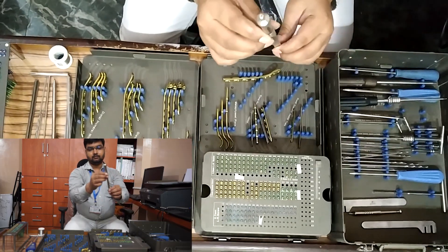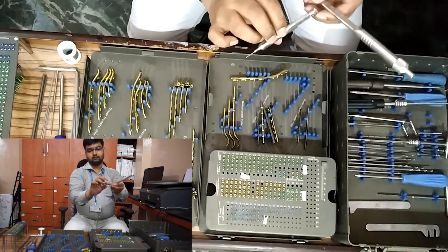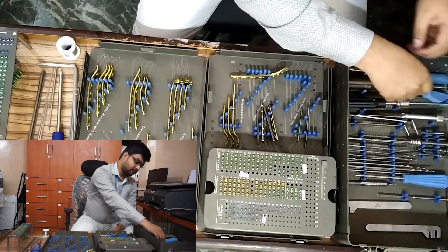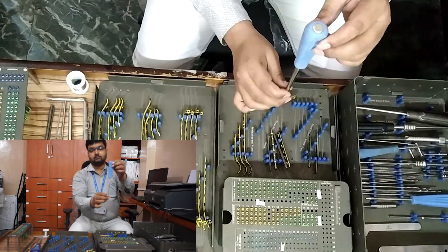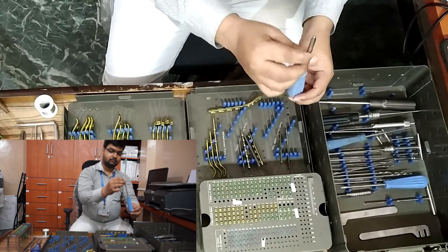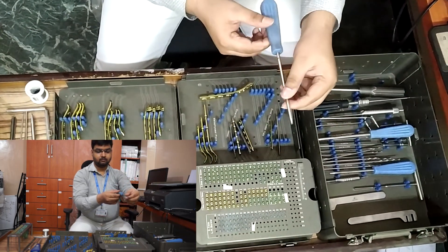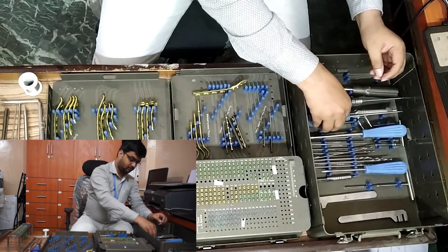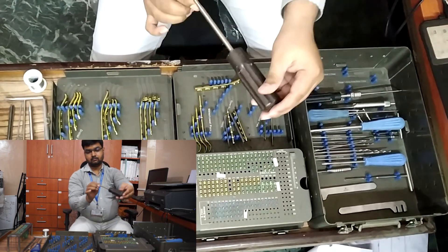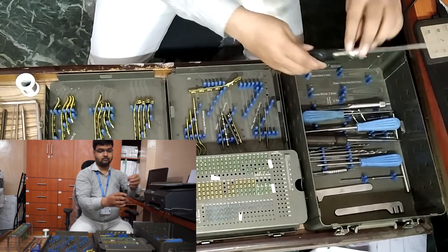Depth gauge: 3.5 mm, one piece; and 2.7 mm, one piece. Screwdrivers, hexagonal: 3.5 mm, 150 mm in length, one piece; and 2.7 mm, 150 mm in length, one piece.